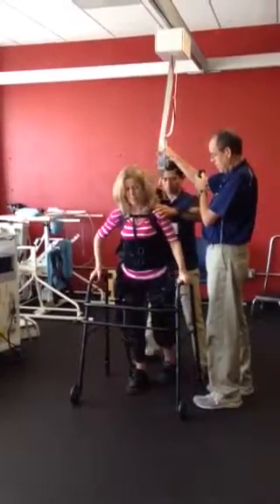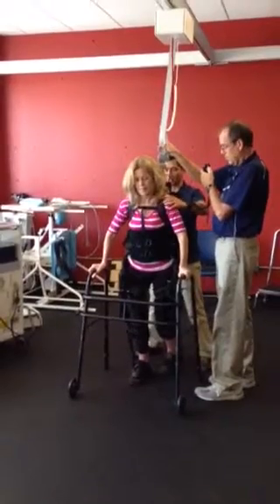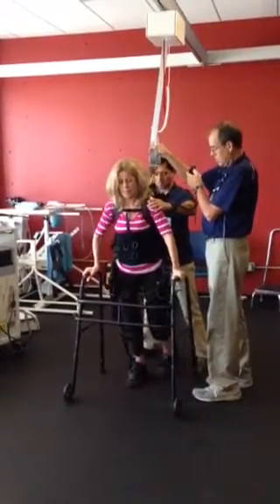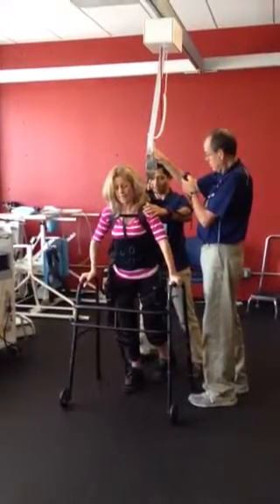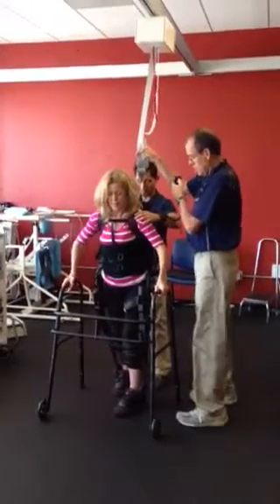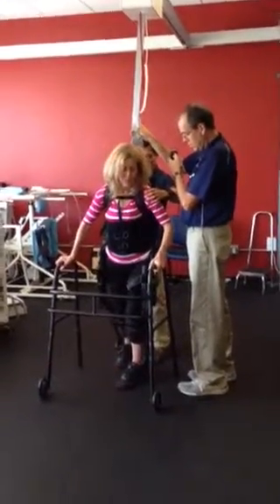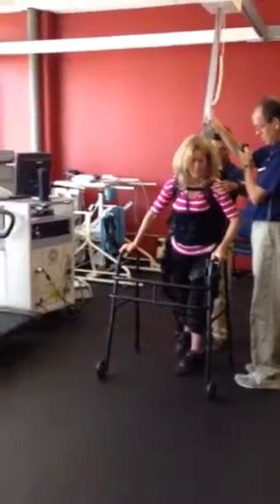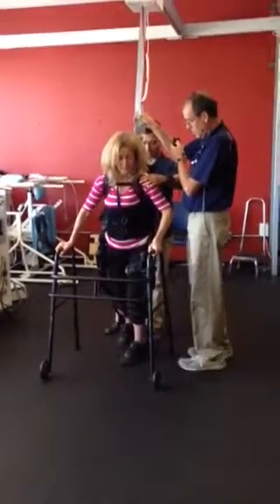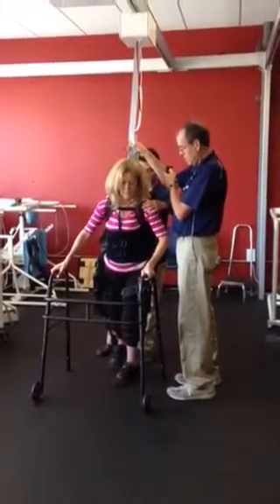Good. A little more to the left side — you're falling left now. A little more to the right. Right there. Hold that. Hold it. And step. Good. Walker. Get over that left leg. Let's go to this side — a little more, and forward. Right there. So you're starting to fall back to the right, so lean more to the left. Perfect. Hold it there and step.